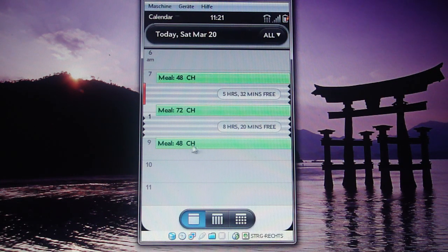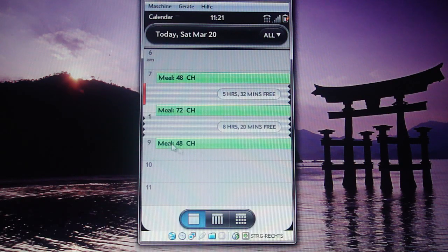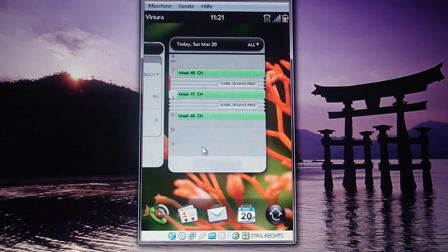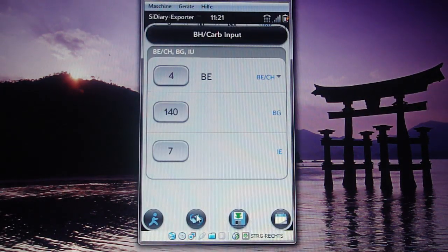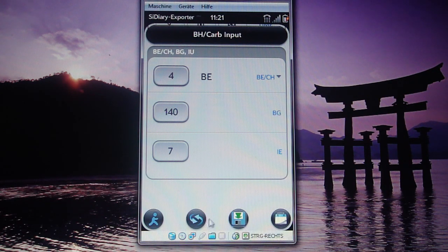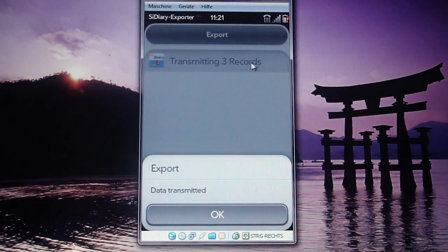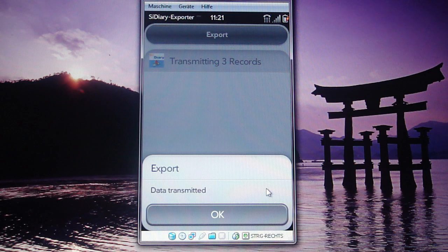You can see that even though I entered 4 BEs, it's been saved as carbohydrates. To synchronize this to AZ Diary, you just hit the little sync button and it says it's transmitting three records — because I only had three for that day — and successfully transmitted.